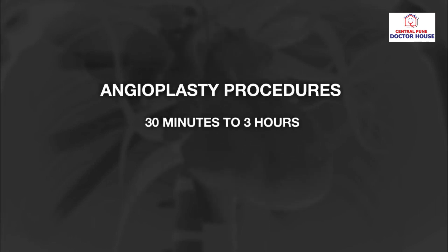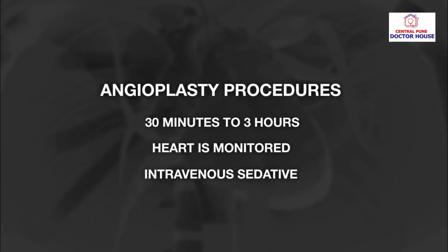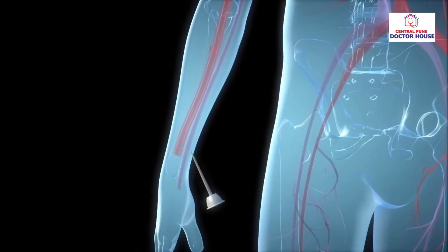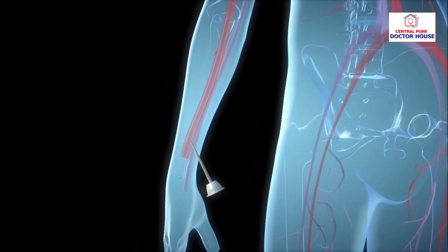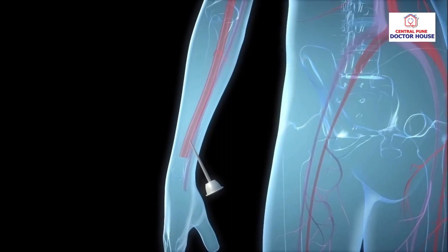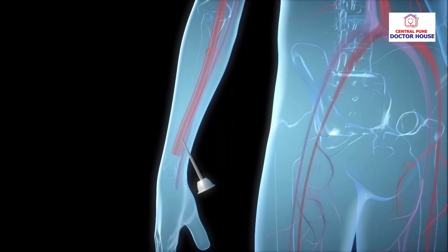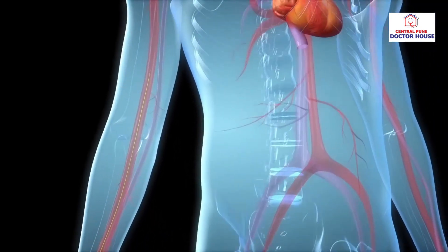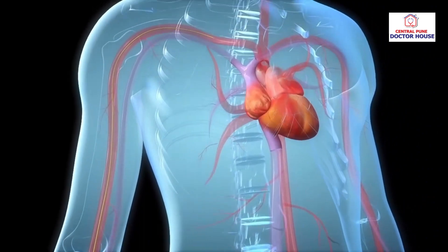Once the patient is admitted, their heart is monitored and they are given an intravenous sedative to relax the body. A needle is then inserted through the wrist into the radial artery, and a guide wire is passed through the needle.